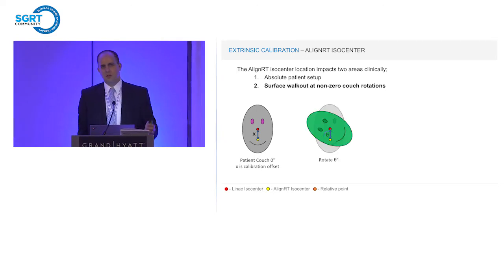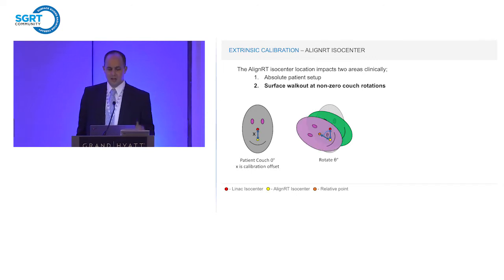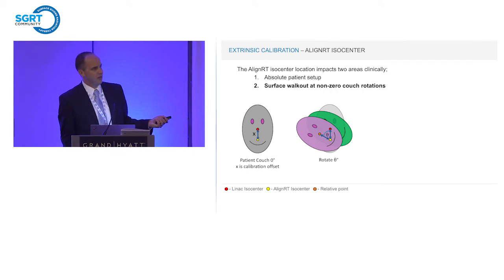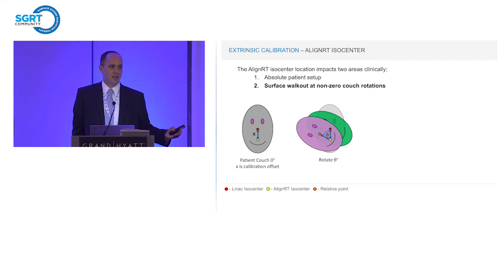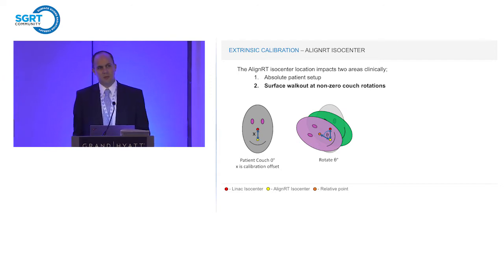So we go ahead, our treatment plan has a couch rotation, and the patient rotates perfectly in this example around treatment isocenter. We then rotate our surface, but our surface, Align RT, only knows where the isocenter is based on how we calibrated it. It uses the information of this yellow isocenter point, so it rotates around the yellow isocenter. You can clearly see here there's a discrepancy between where Align RT expects us to be versus where the patient actually is, and the patient's in the correct place. We're going to get some real-time delta values as a discrepancy between the two.